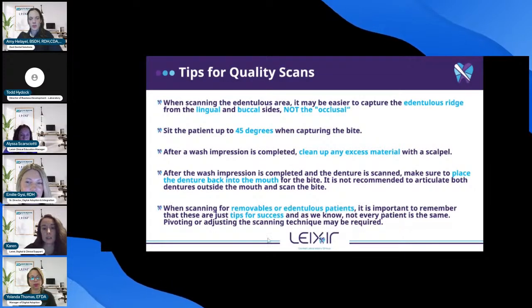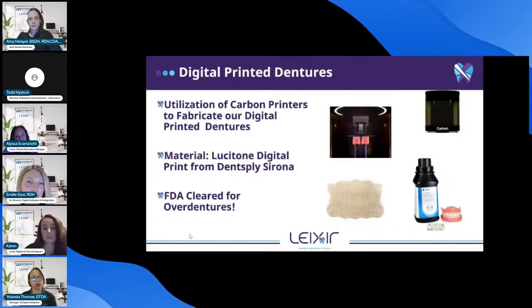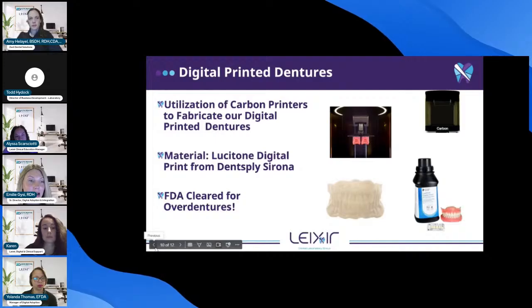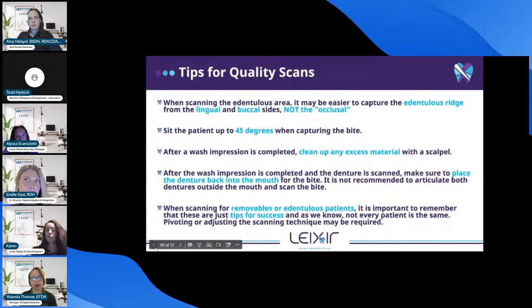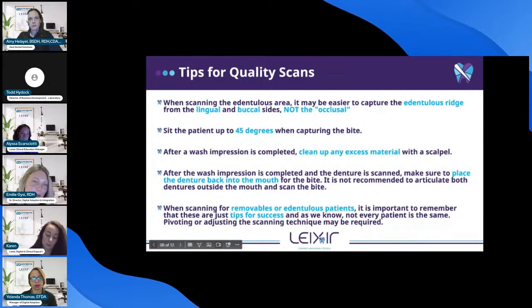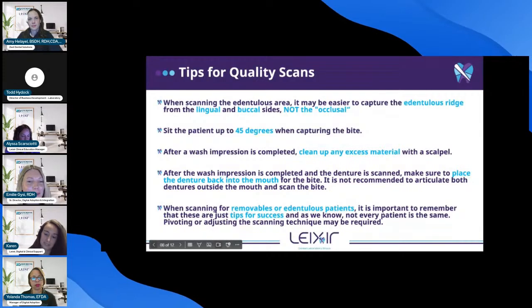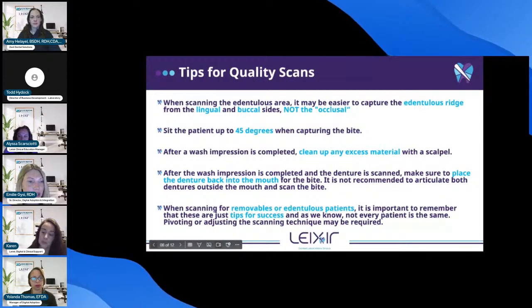One thing I'll add is another tip for scan review. I always like to look at the scan in monochrome and color. That can really help when you're looking in the monochrome or stone view, if you're familiar with that verbiage for your scanner. It really helps to see if there are actual stitching issues.